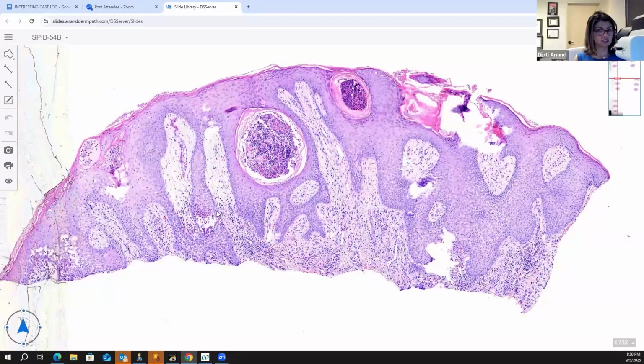So, this is a common thing that mistakes people. Plasma cells are common to locations such as the lip, the genitalia, any intertriginous groin site. They can also be seen on the thigh and sometimes on the legs. So unless it has a whole lot of diagnostics on the scalp as well, I don't take them into account.